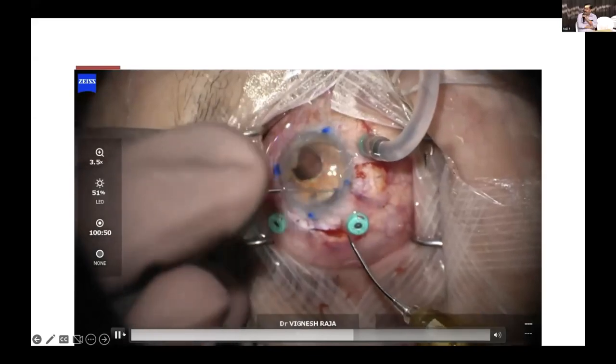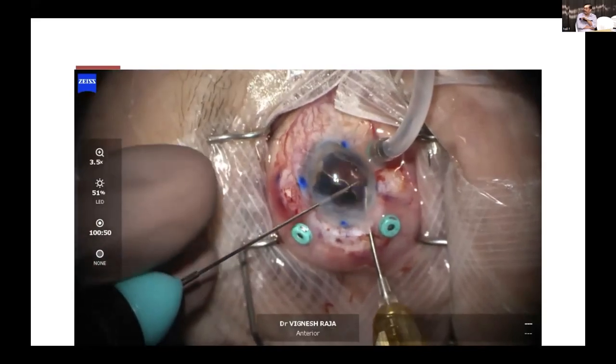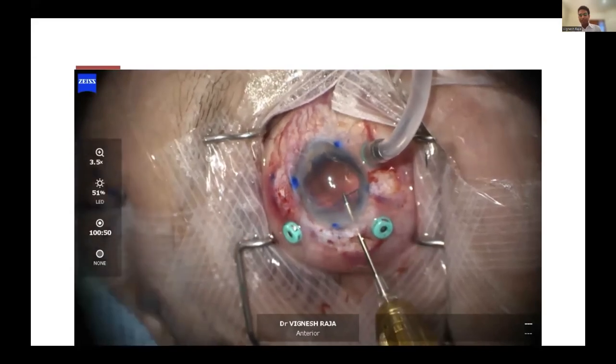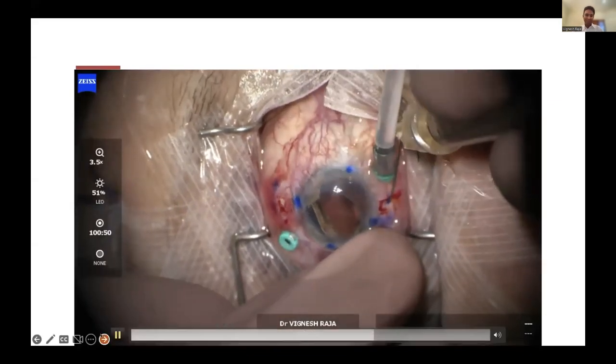This is a very difficult maneuver. Well done. It has to be appreciated. It's a highly complicated maneuver. Yeah, in fact, that's why I had a stay suture there, just in case it falls down, so I can cling on for dear life and pull it up. So that's it.